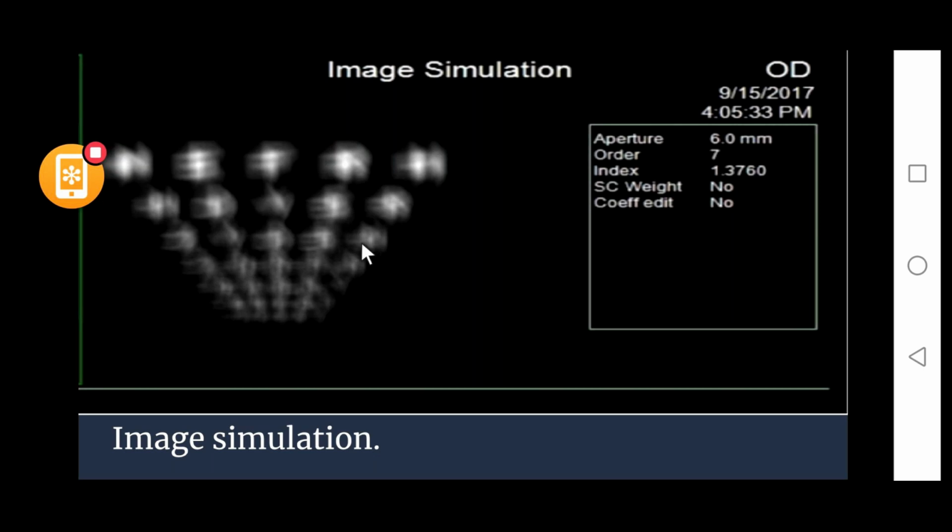So basically, this can help you in understanding objectively how the patient is seeing, due to the anterior surface of the cornea. Afterwards, I will be asking some of our friends how more we can use this, but not right now, at a later stage of the lecture or at the end stage of the lecture.